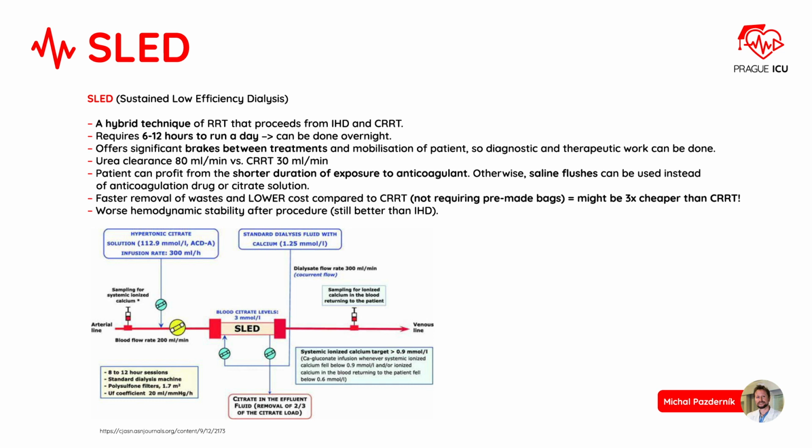In contrast, we can observe worse hemodynamic stability after the procedure, but it's still better than intermittent hemodialysis.